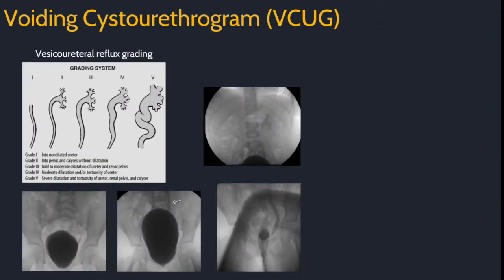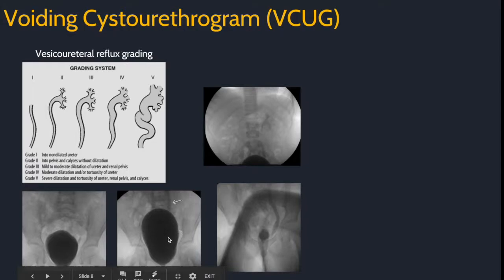Voiding cystourethrograms (VCUGs) are also a main fluoroscopy responsibility for a pediatric resident. Contrast fills the bladder via a catheter as you watch it fill. The main question is: is there reflux, and what grade is the reflux? Use this grading system to answer those questions. Here are representative images of a VCUG with bladder filling, bilateral reflux, and grade 3 reflux.